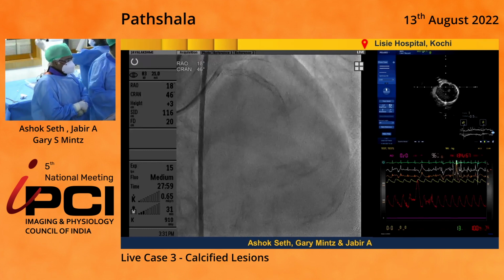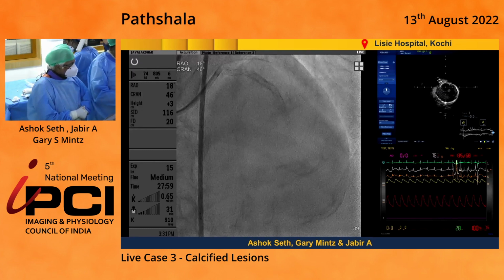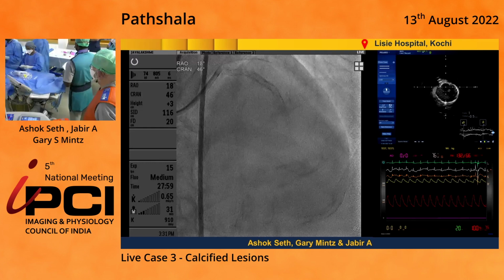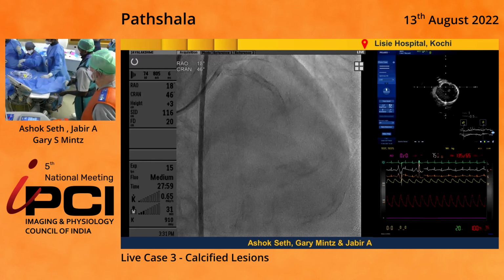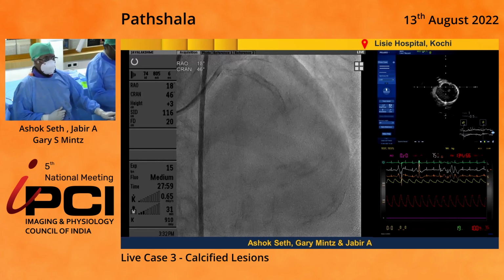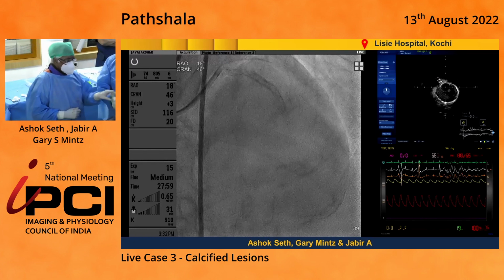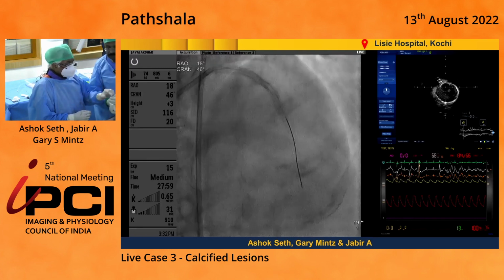There is also an OCT catheter here. Any particular reason to use IVUS and not OCT? Oh, good. Thank you. So we're now going to do an IVUS and let you see those pictures, but it does look visually better. So can I have the needle to shape this wire? This needle there? Yeah.